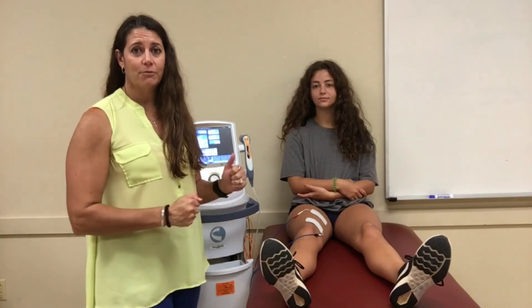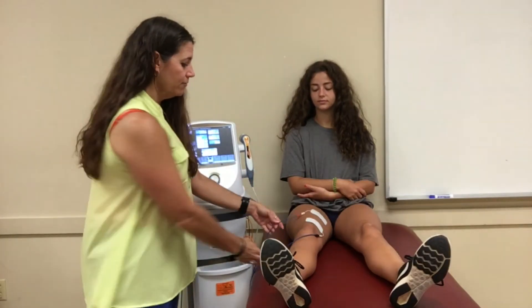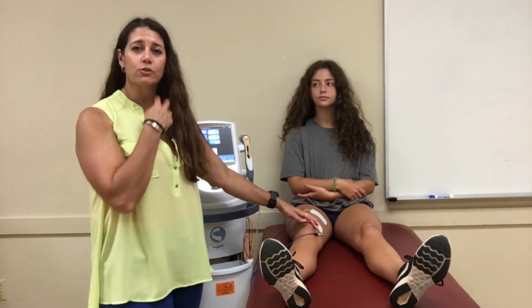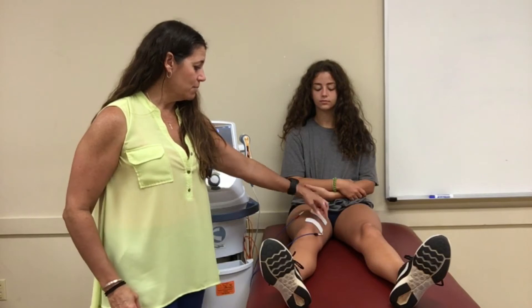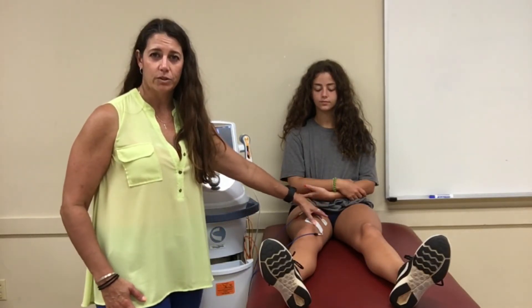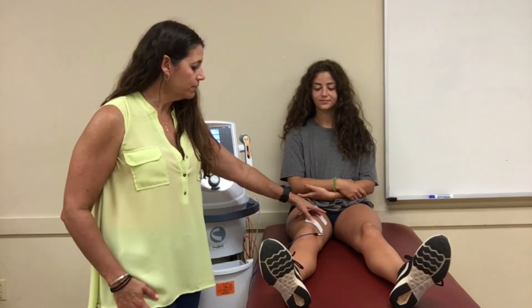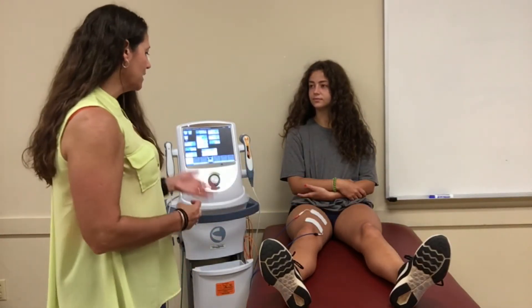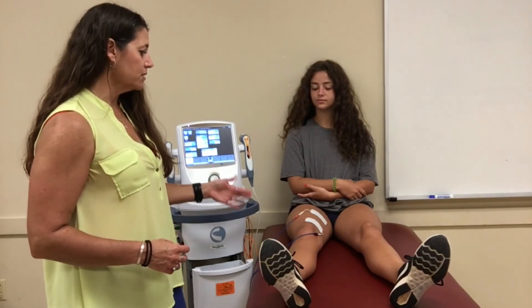So now we have Russian — also known as NMES — all set up. We have lead one with both pads. Typically after an ACL surgery, the major muscle we need to focus on is the VMO, which is why the pads are placed lower, toward the middle or upper edge where you can really access the VMO. We're on lead one, just as originally set up, and I'm going to show you how we set up the intensity.